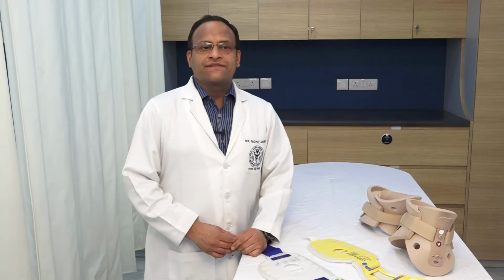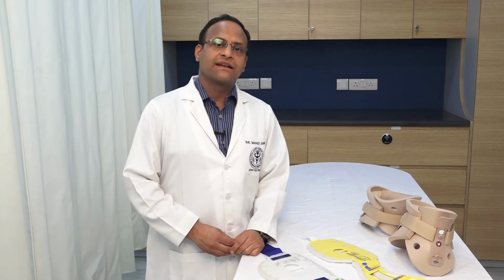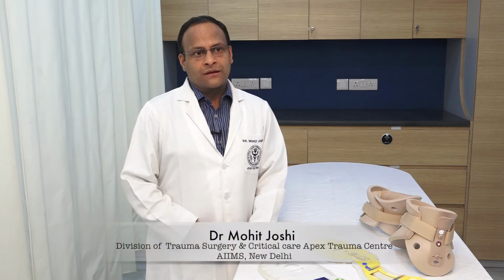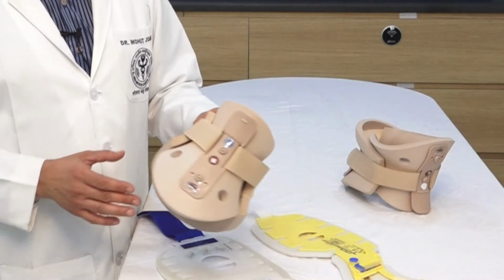So hello, as we know, the cervical spine of all trauma victims should be considered unstable and requires to be protected by application of a cervical collar early in their management while assessing and managing the airway. So every healthcare professional should be aware of how to select an appropriate size collar and how to apply it. In the market, various types of cervical collars are available.